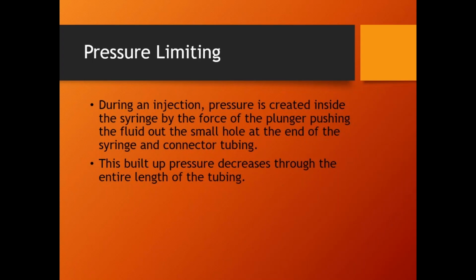But anyway, so that's what happens. If the injection hits its maximum pressure, it just backs off the flow rate a little bit, and then continues with the injection. Now, not every single model, but most of the models, there will be some audible tone that will sound alerting them that the injector has hit its pressure limit. But if the injection is still going, they'll typically just roll it.